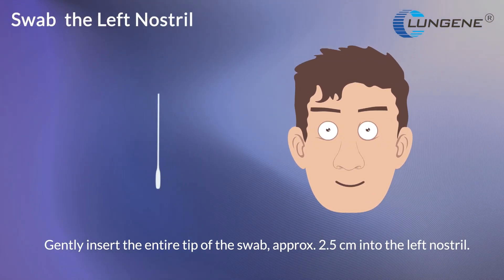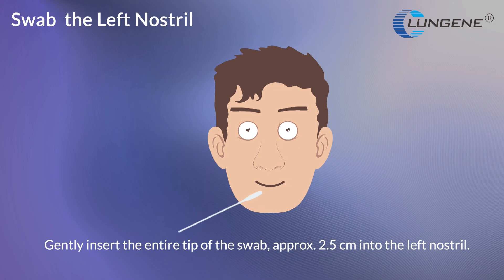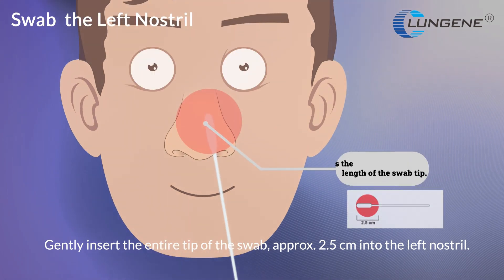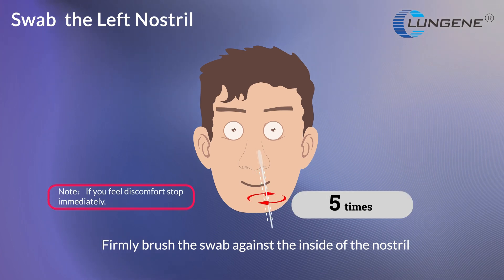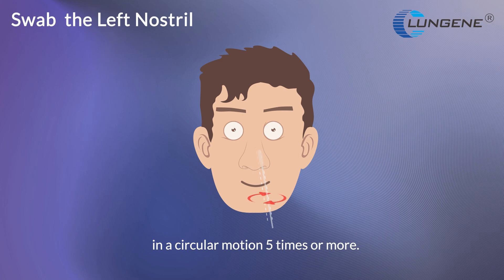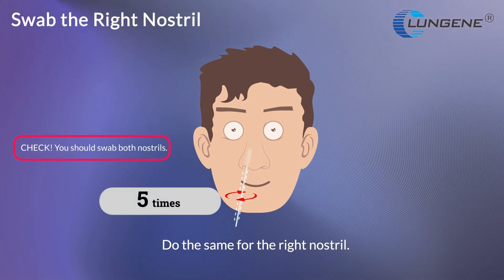Gently insert the entire tip of the swab, approximately 2.5 cm, into the left nostril. Firmly brush the swab against the inside of the nostril in a circular motion 5 times or more. Do the same for the right nostril.